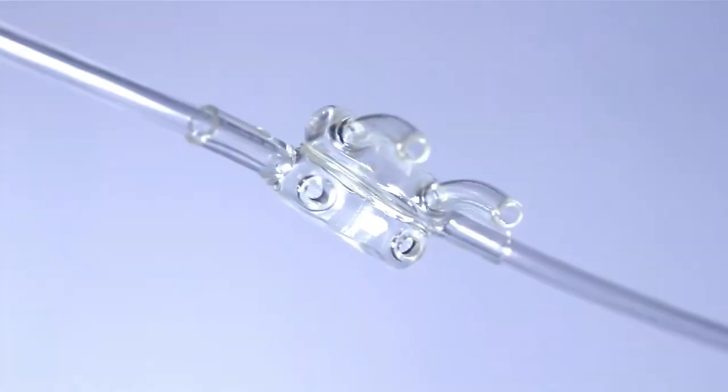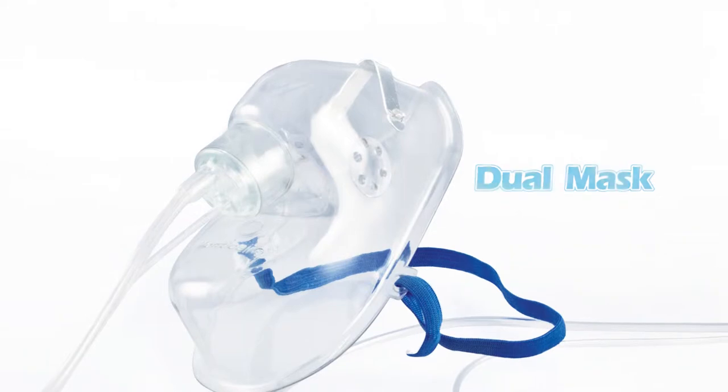CO2 is sampled from both nostrils for sidestream CO2 monitoring through the upper prongs. Fresh oxygen is delivered to both nostrils via the lower prongs of the dual nasal cannula.